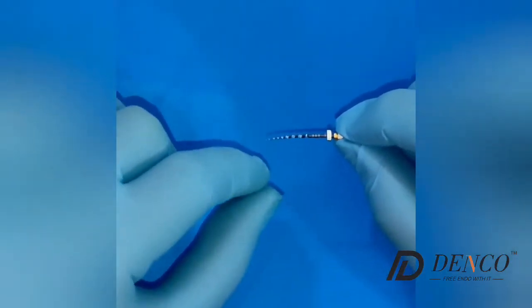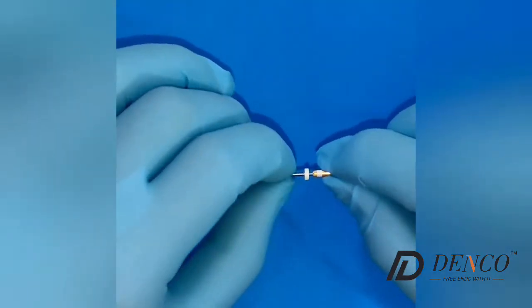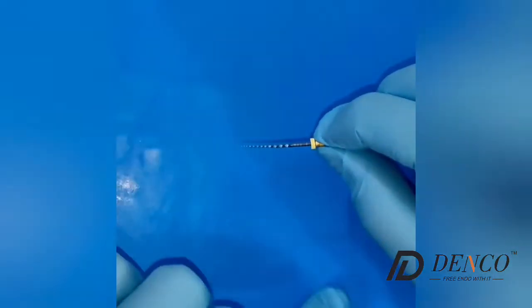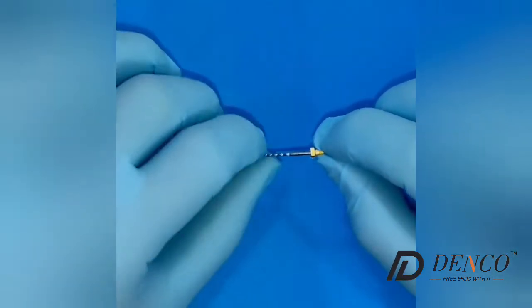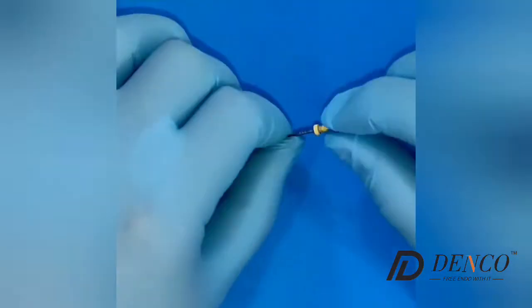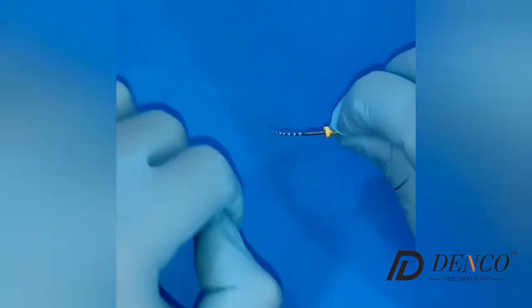They are not supposed to be too active in the tip, but you can take them to the working length as well. And you have the F1 — these are the finishers. You can finish the canal with the F1 if the canal is narrow. As you can see, they are also flexible.